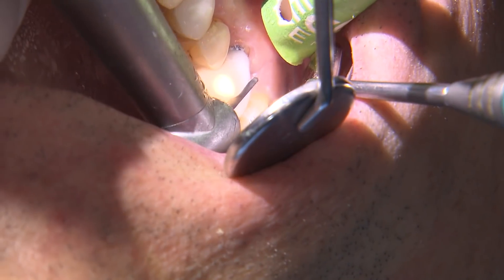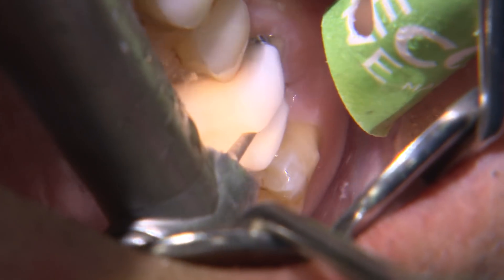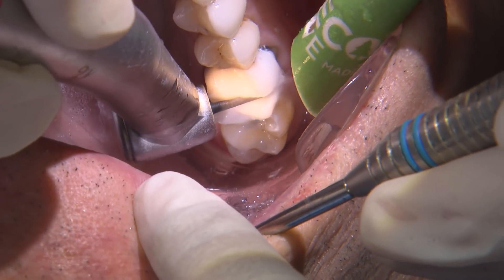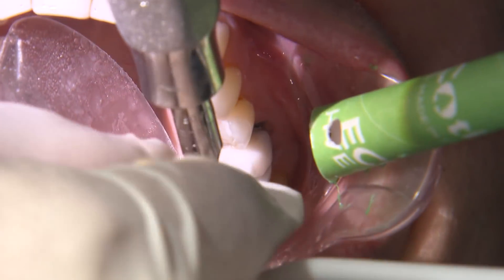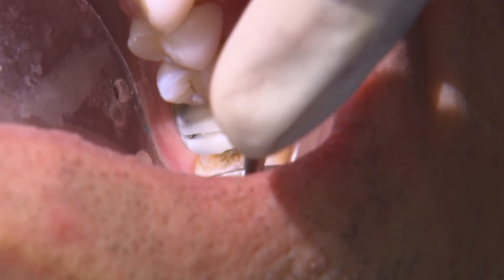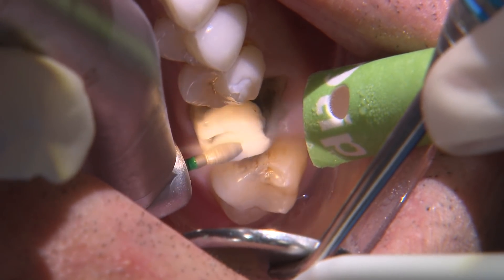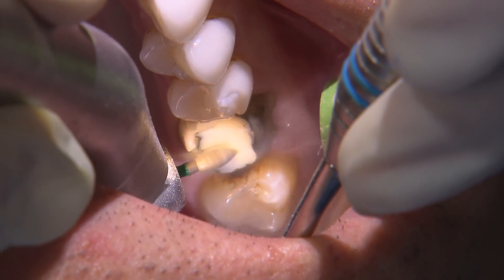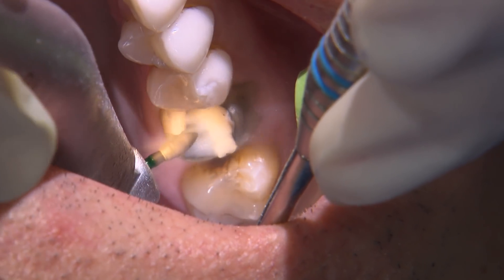I make sectional cuts along the buccal, occlusal, and lingual to the depth of the prep with a zircated diamond burr. I ran into an issue here when trying to separate the crown with the Christensen crown remover — when I twist it clockwise to separate the crown, part of the lumineer on the second premolar fractures off. Next time I'm in a similar situation, I'll add a mesial to distal slot on the occlusal and try separating along that to hopefully apply less force against the adjacent teeth.